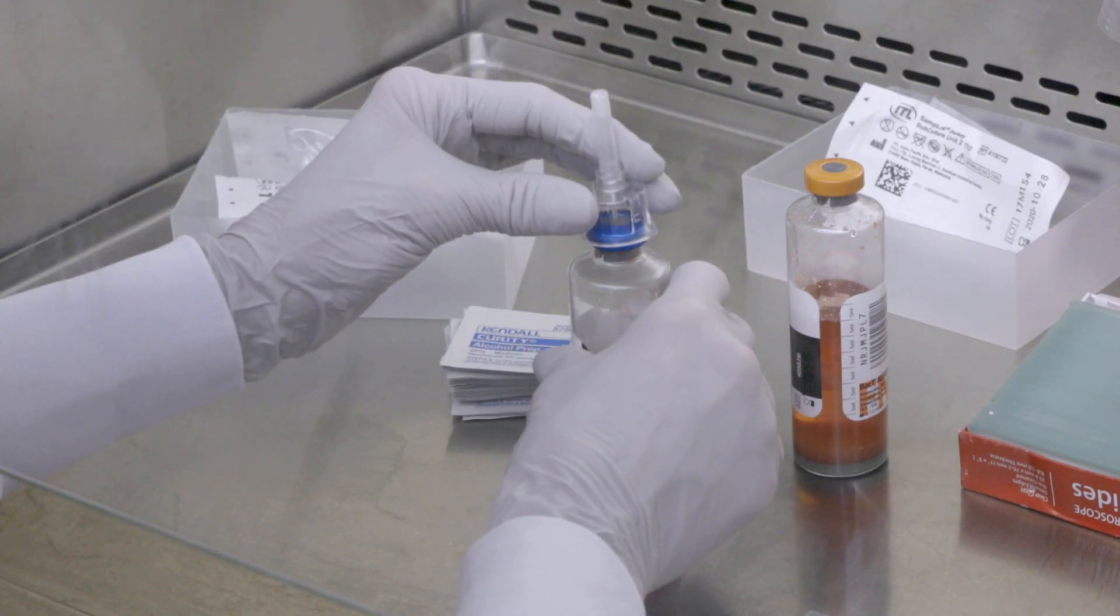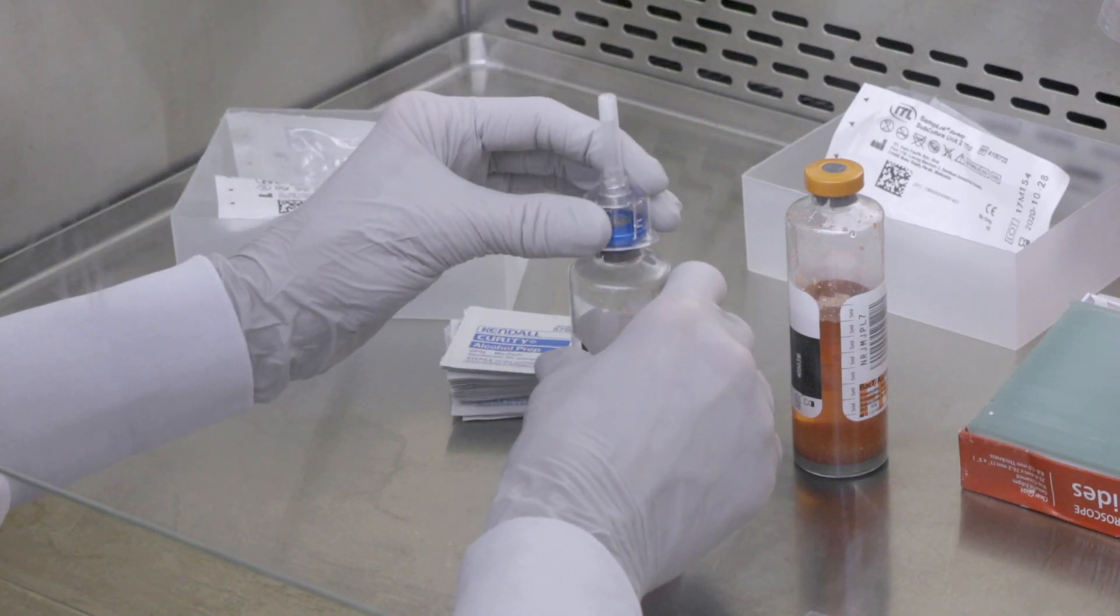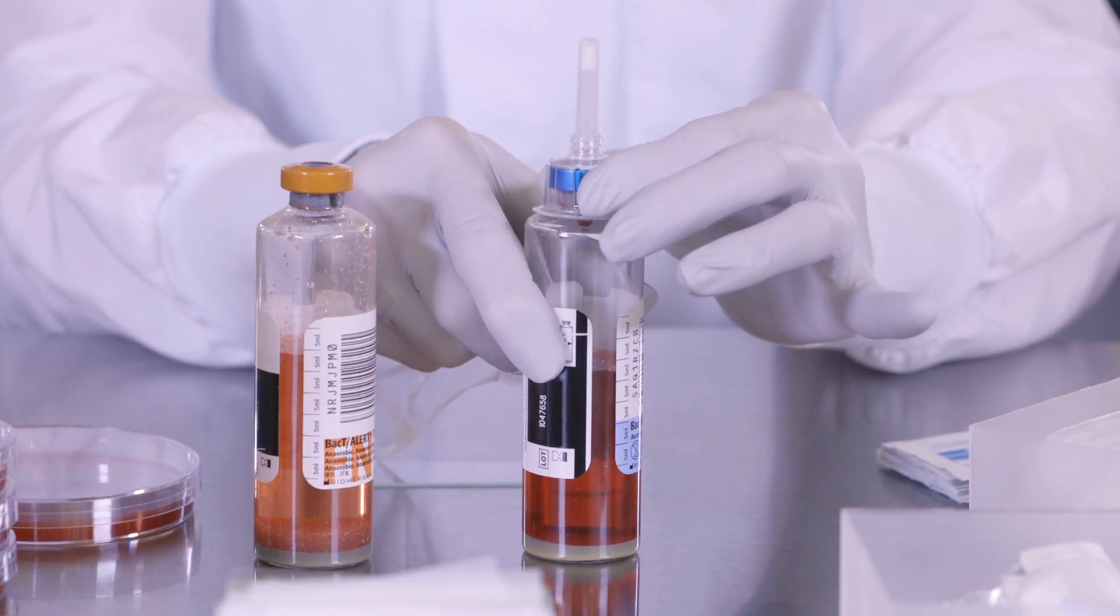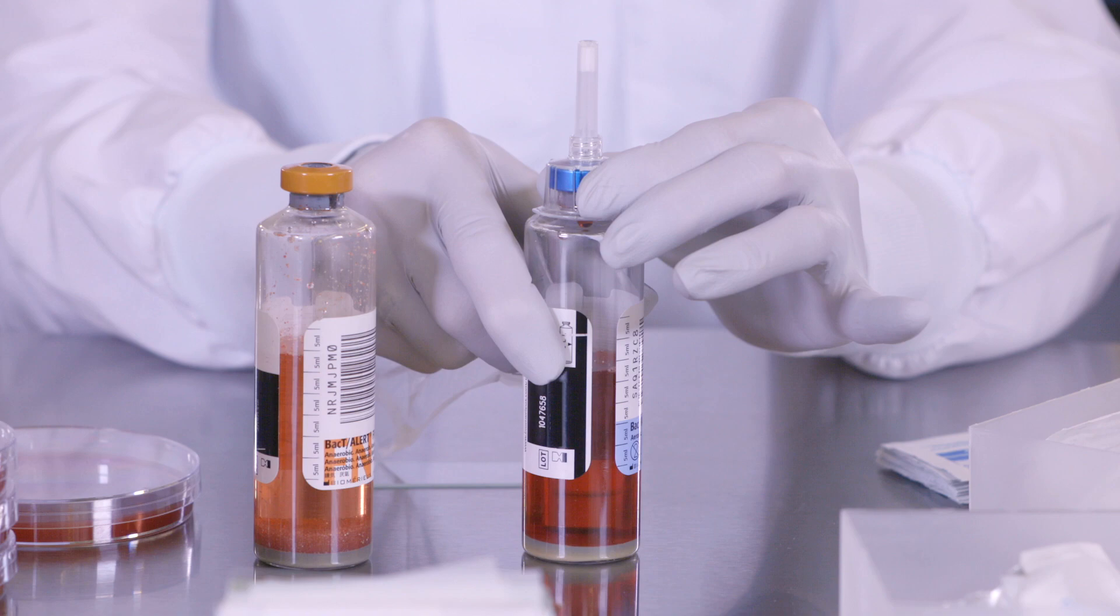Insert SCU-2 into the bottle septum by holding the bottle with one hand and with the other hand, place SCU-2 over the center of the culture bottle septum. Now, press SCU-2 down, inserting the piercing tip into the septum.